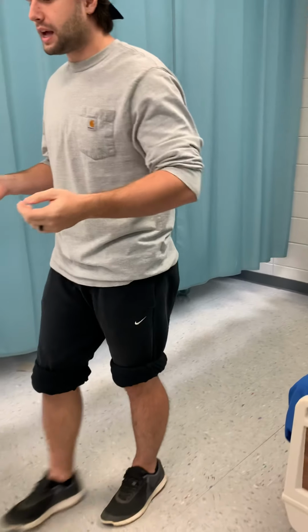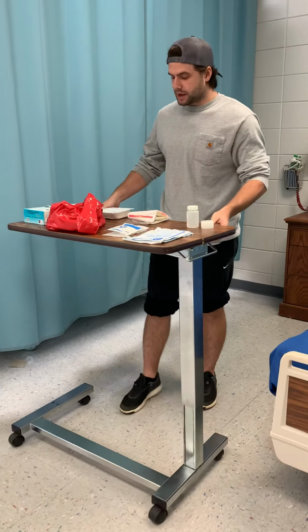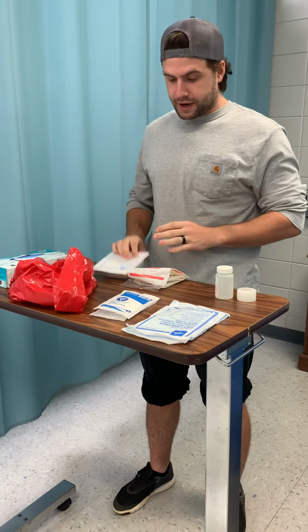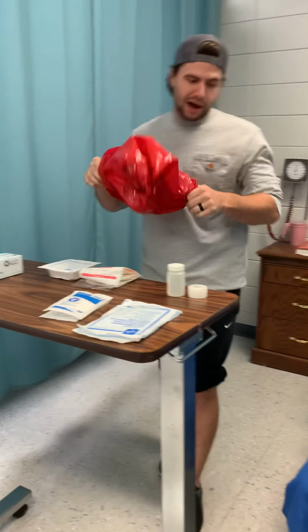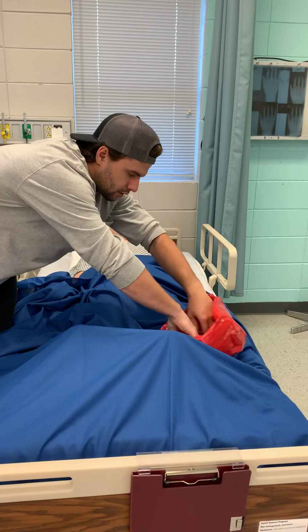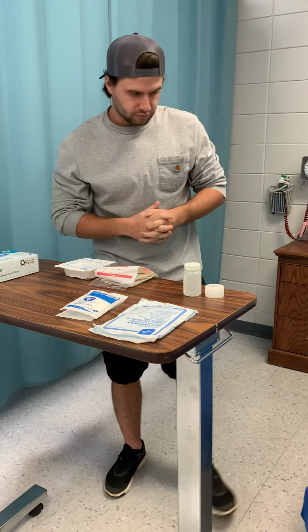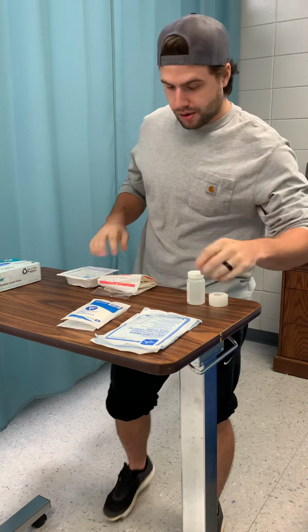After this, I will collect my supplies. I will inspect my supplies to make sure that they are not damaged, make sure the expiration date's right. I will place my biohazard bag at the foot of the bed so I can discard my supplies easily. I will then perform hand hygiene and set up a sterile field.